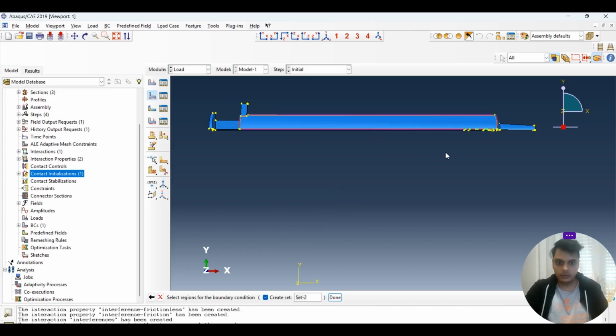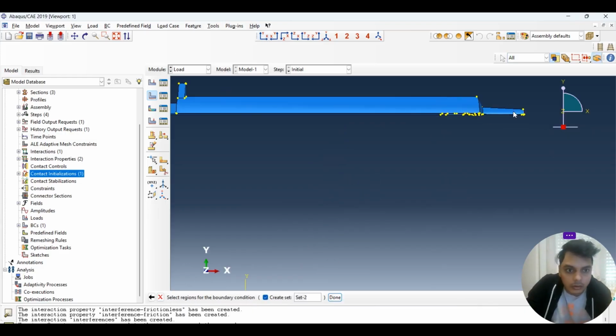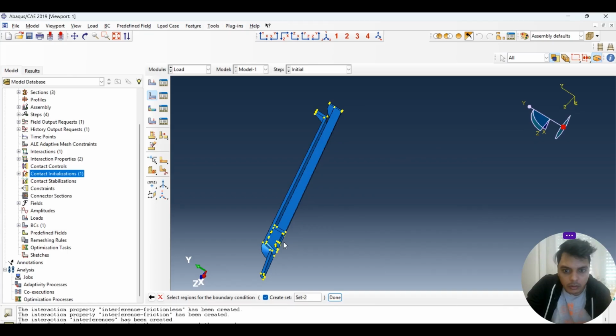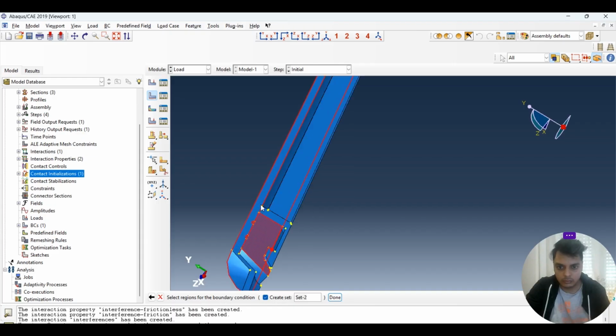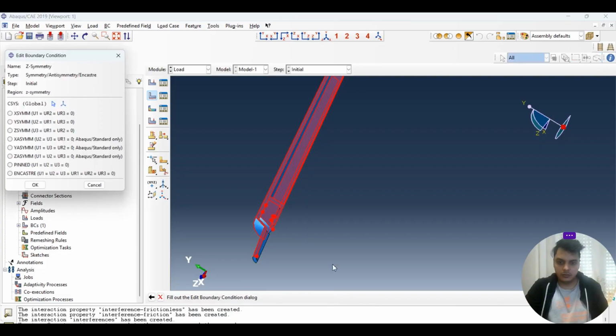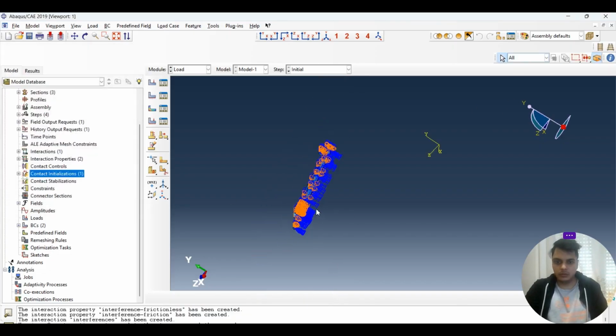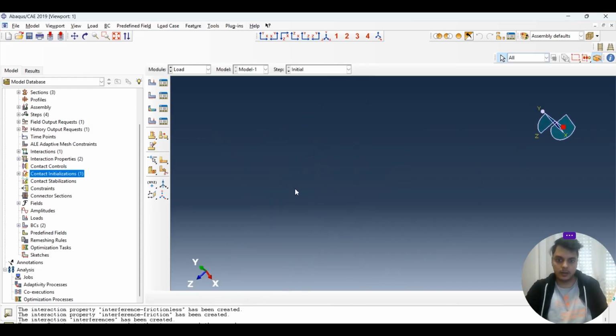It's the Z symmetry, so we have to select. Hold on. Okay, so this part should be Z symmetry. We select here. Okay, and we have to say symmetry. Okay, so this is what we have defined. Now, what we want is the barrel.